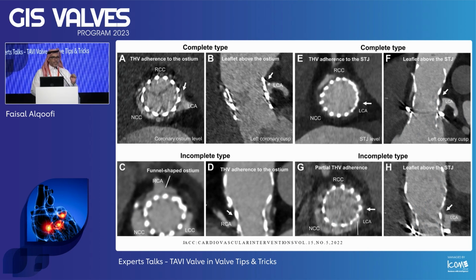Before I move to the case, this is a very important concept that Dr. Mohammed is explaining. But I just want to point out this concept of VTC of the STJ literally became available to us in 2022, based on a trial of literally 28 patients who were already deemed to be high risk and were going for BASILICA. And even with that, I will show you the algorithm. But even to this date, I do not know how to put the VTC of the STJ when I have a VTC of the left main more than 6. Do I need even to calculate it?